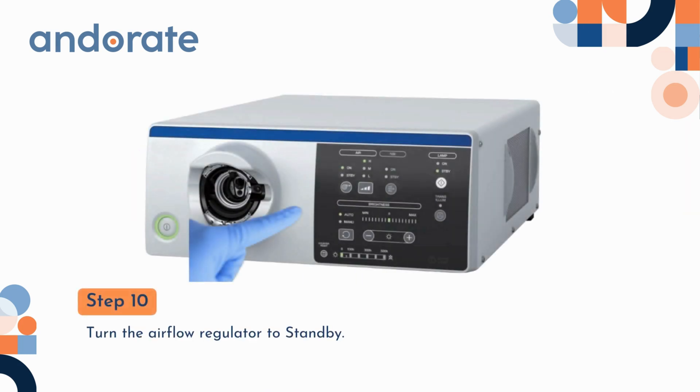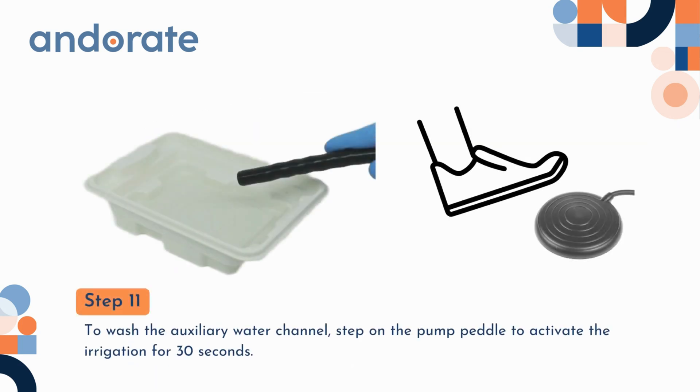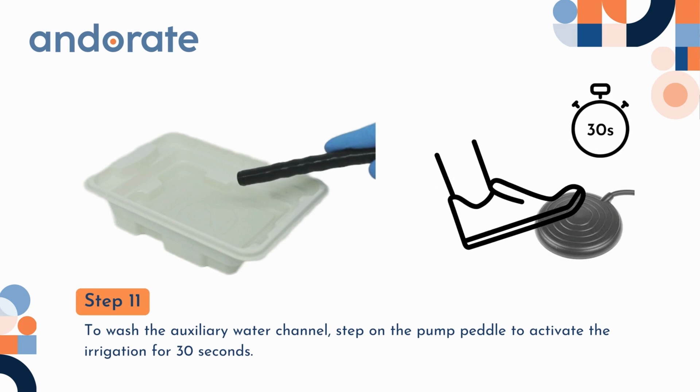Step 10. Turn the airflow regulator to standby. Step 11. To wash the auxiliary water channel, step on the pump pedal to activate the irrigation for 30 seconds.